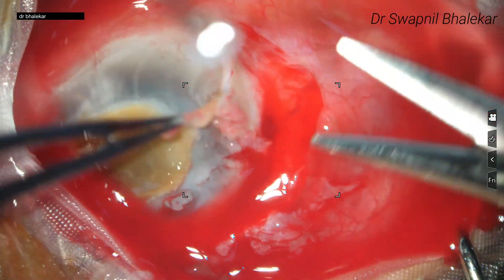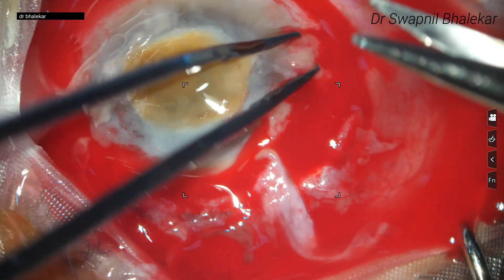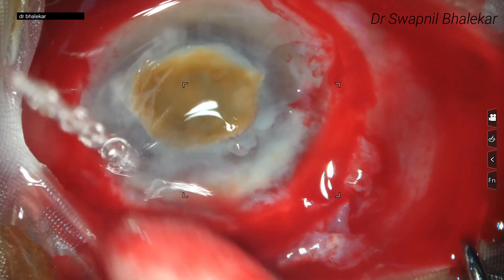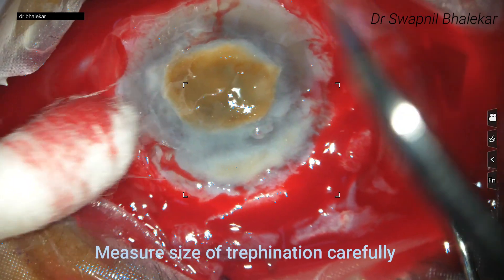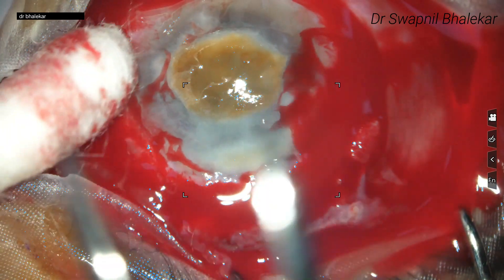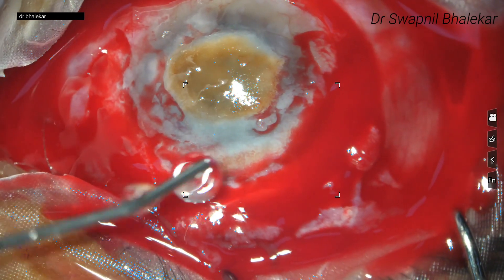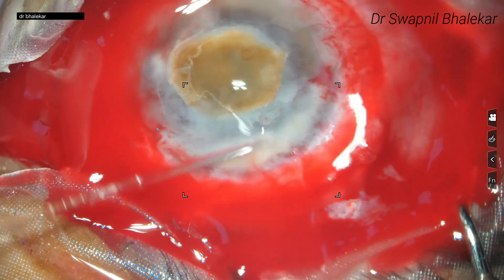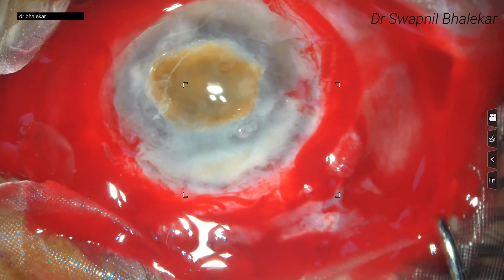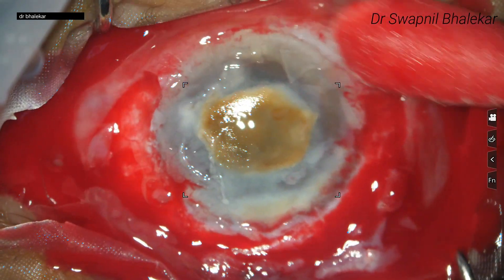Here you can notice we have completed a 360-degree conjunctival peritomy. There is a lot of bleeding at the periphery but as I said we have avoided cautery in this area. The size of the infected cornea is measured using calipers in both vertical and horizontal meridians, and then accordingly the size of the trephination of the recipient should be carefully determined. Ideally, a 1 mm rim of healthy corneal tissue should also be removed to leave a stable non-infected recipient bed. However, in this case almost the entire cornea including the limbus is infected, so we may not be able to trephine a 1 mm margin of healthy tissue.